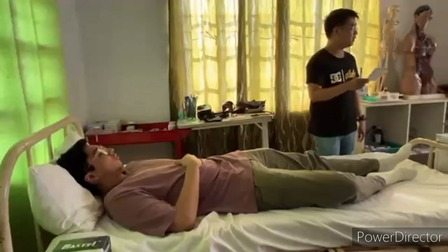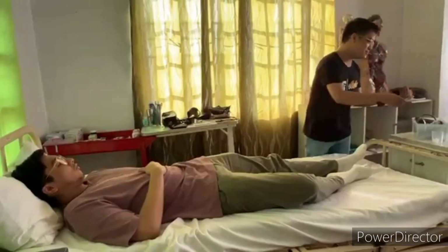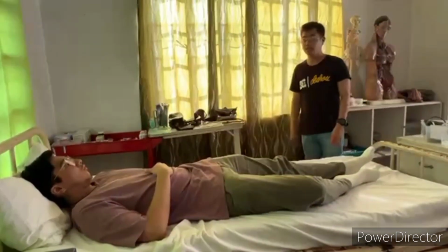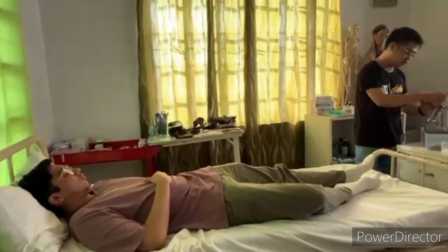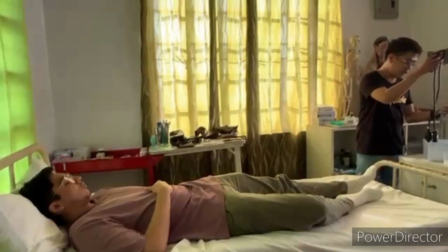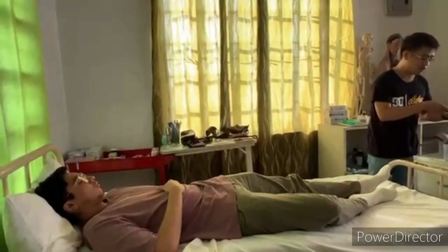Okay, so after documenting the TPR of the patient, put that tri-pen and the tickler in the box and then get the blood pressure of the patient. In getting the blood pressure, we're going to be using the stethoscope and the sphygmomanometer. Okay? Before using the stethoscope, we have to clean it first using the cotton ball soaked in alcohol.